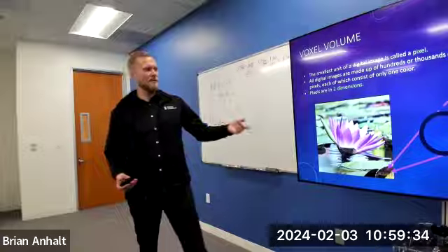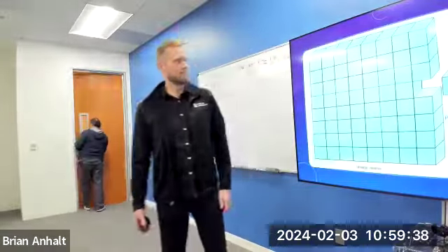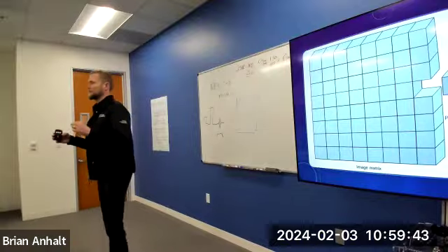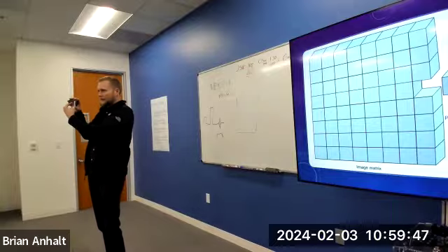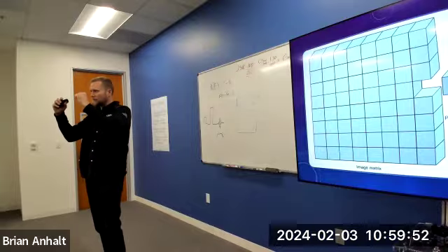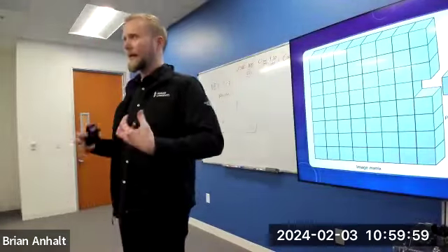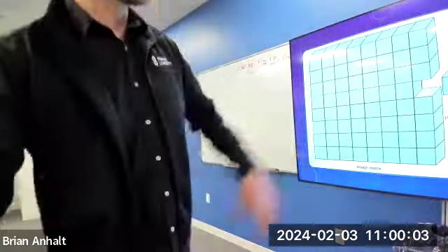Pixels are in 2 dimensions though, right? There's not a third dimension here. In MRI, they're voxels. Because in MRI, we excite a slice of tissue. We're not just opening the body up and looking at it as a 2D surface. We actually have to excite protons. And to do that, there has to be a volume excited, right? So in MRI, when we're looking at the picture, it looks 2 dimensional, but it came from 3-dimensional data, a 3-dimensional excitation.